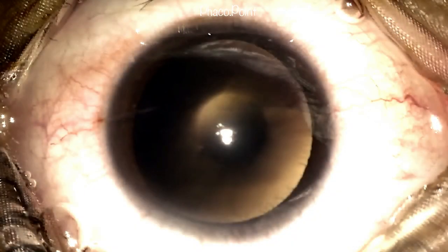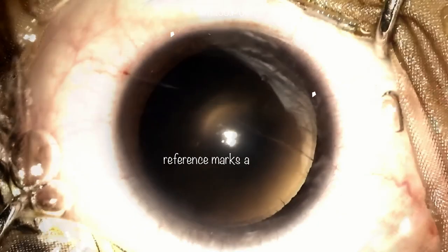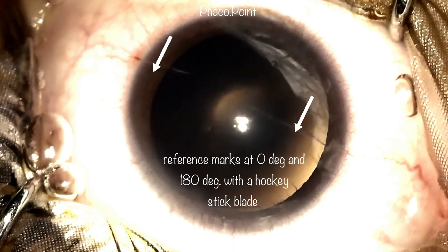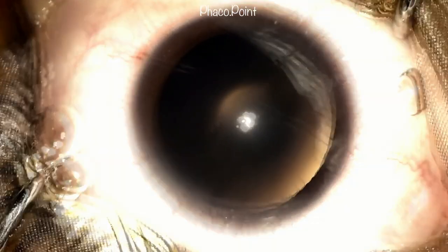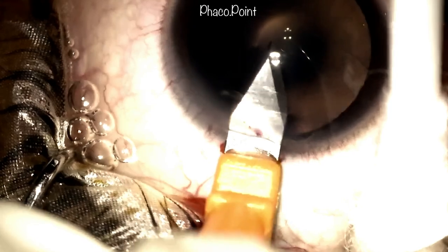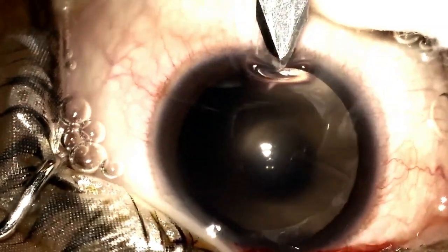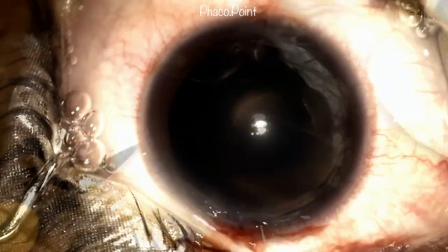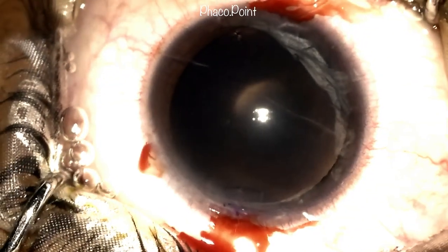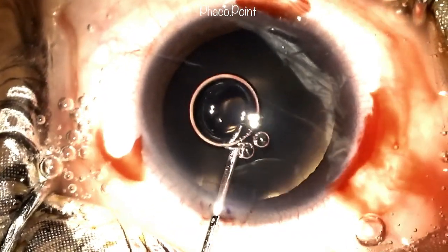This patient with anterior lenticonus had a very soft cataract. The plan was to perform phacoemulsification with implantation of a monofocal IOL in the capsular bag. Notice the central oil globular reflex induced by the anterior lenticonus as we begin with the incisions. To address the corneal astigmatism, an opposing clear corneal incision is made at about 80 degrees.